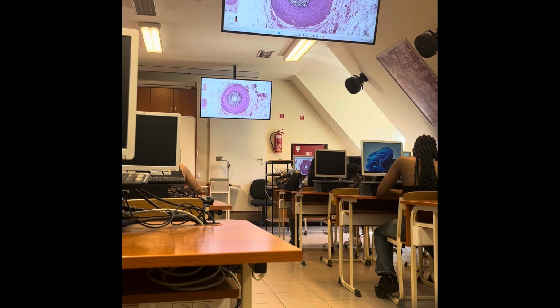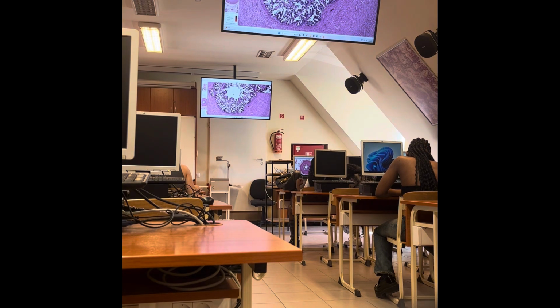Okay, so first of all, what we can easily recognize is that the mucosal membrane has changed. The mucosal membrane was not a straight surface, but a smoother surface than in this segment. Lamina propria shows folds, and the epithelium of the mucosa also covers it. So in this way, the mucosa and the lumen of the ampullary part of the ductus deferens have a kind of labyrinthic appearance.